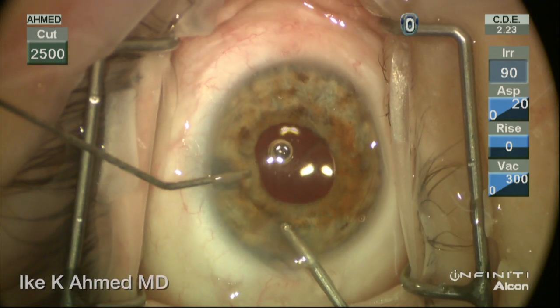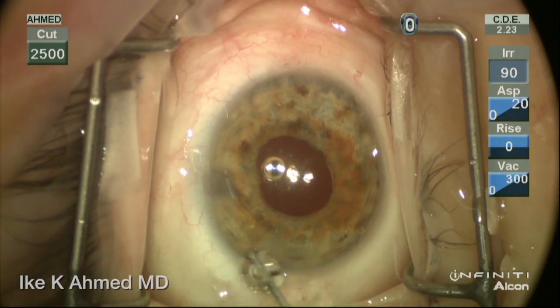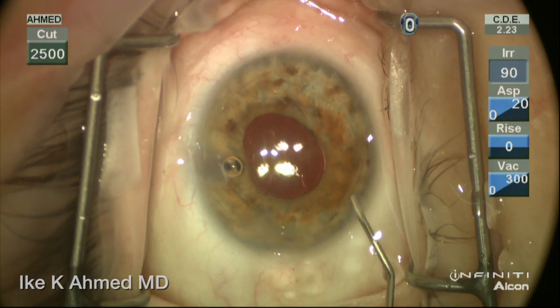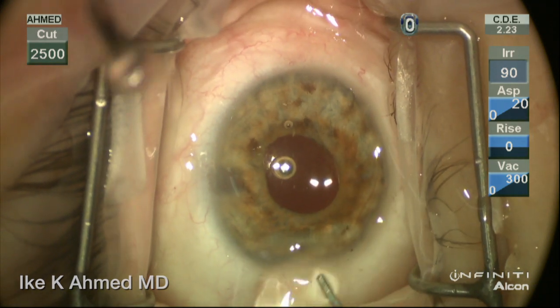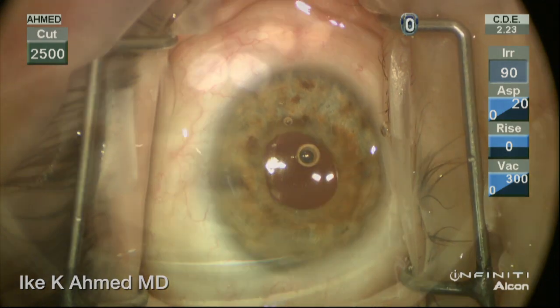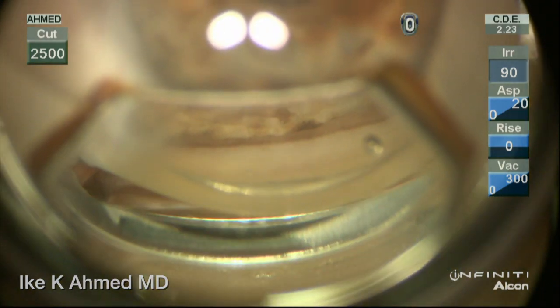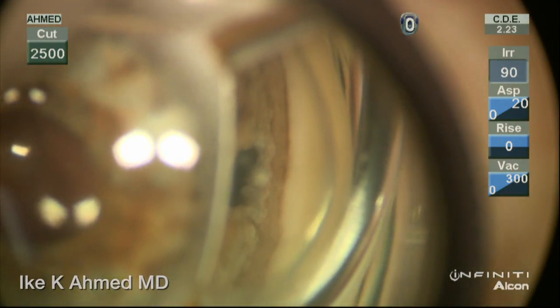This now creates a unicameral cavity, preventing the potential for malignant glaucoma from reforming. We reform the anterior chamber, remove the viscoelastic manually at the end of the case, and ensure a well-formed closed system with a pressurized anterior chamber at the conclusion of the case. On gonioscopic examination, the angle has now opened up nicely after the lens has been removed.